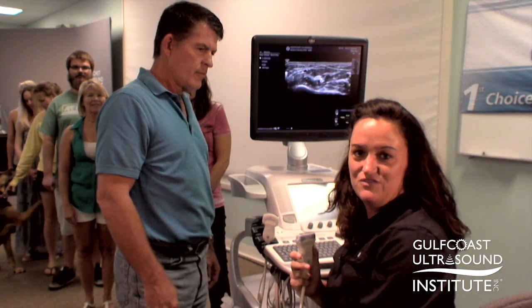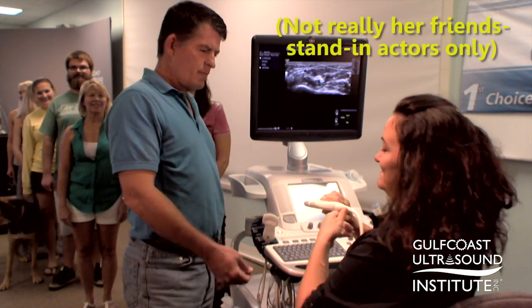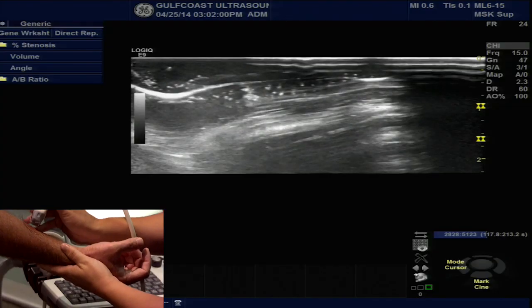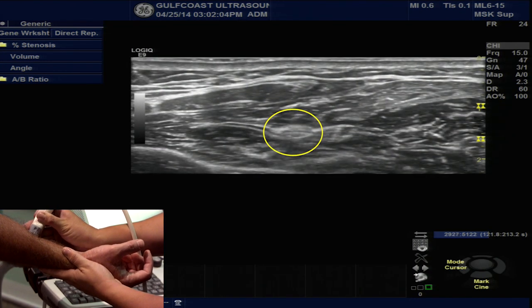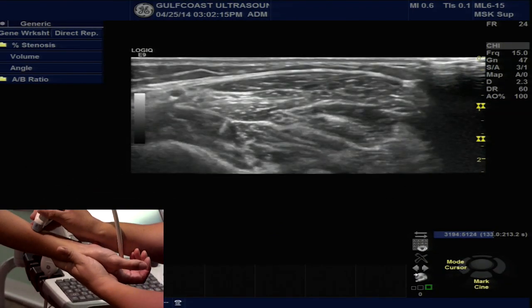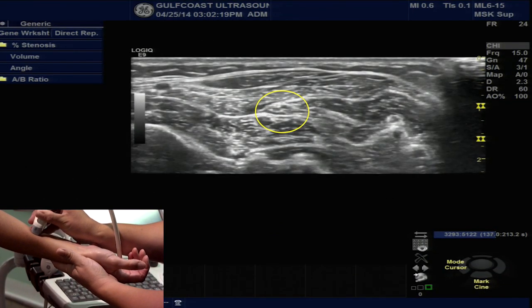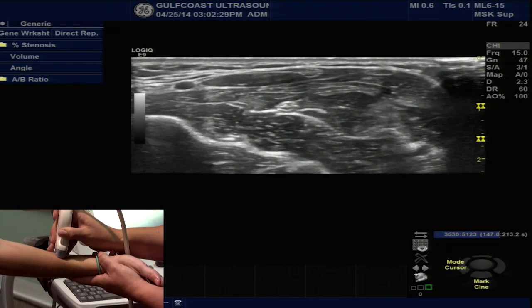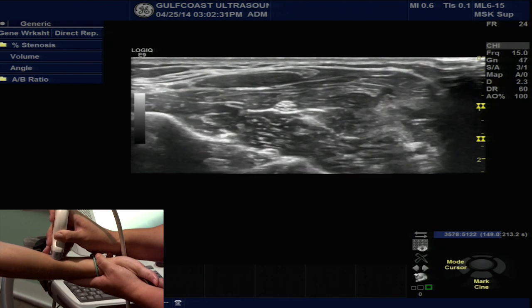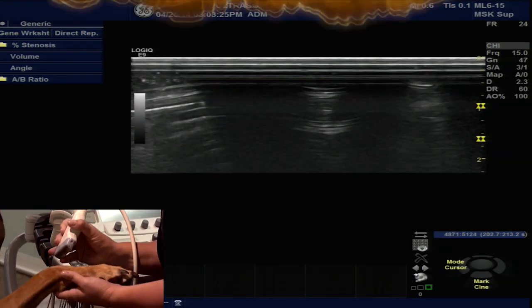Try this on yourself and then try it on your friends — I promise it'll work. Straight down, mid forearm. Can you see it? Smack in the middle. Absolutely gorgeous. Well, maybe not this one.